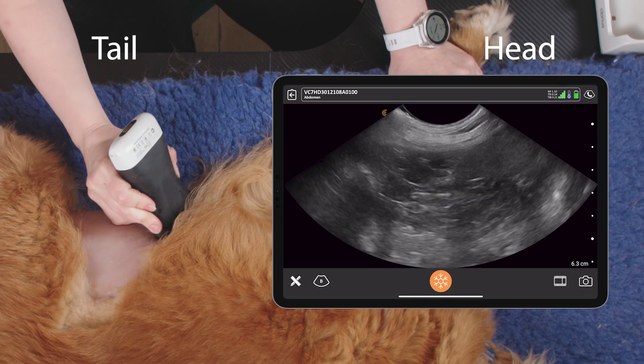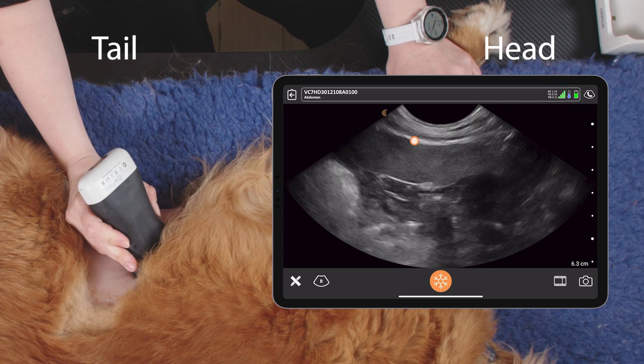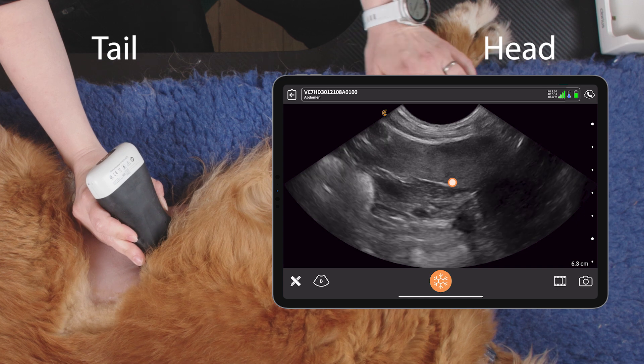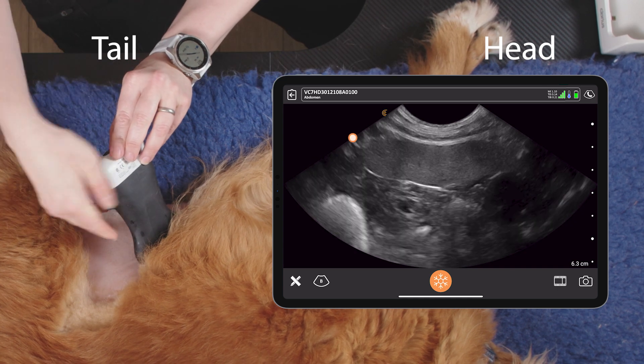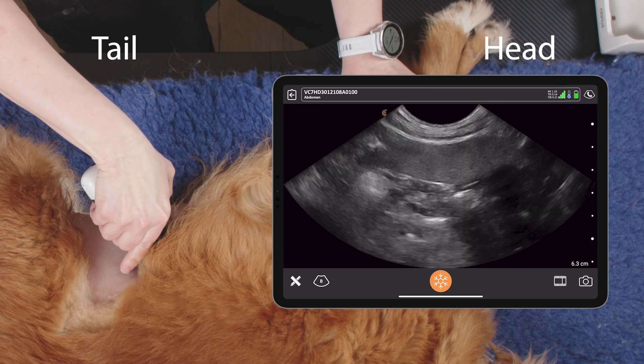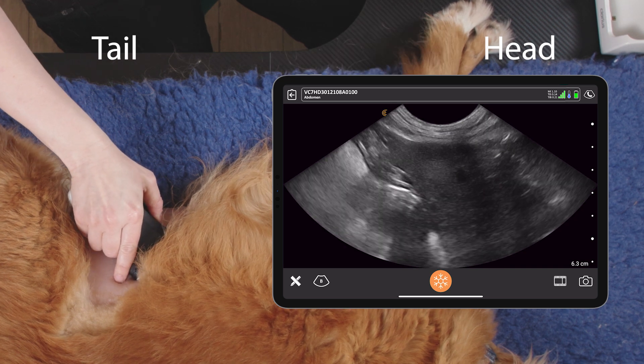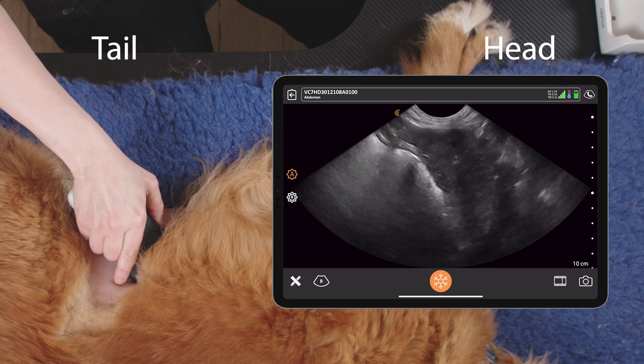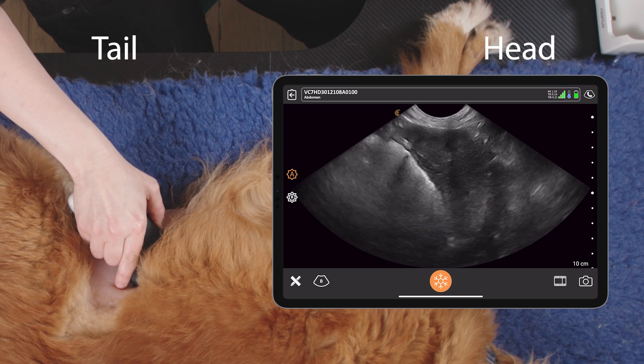We want to follow the costal arch up until we find the spleen. At this point, where we have the stomach cranial and the kidney caudal, we want to look underneath the ribs to look at the splenic head, and we'll need to increase our depth to be able to see the whole of the splenic head.